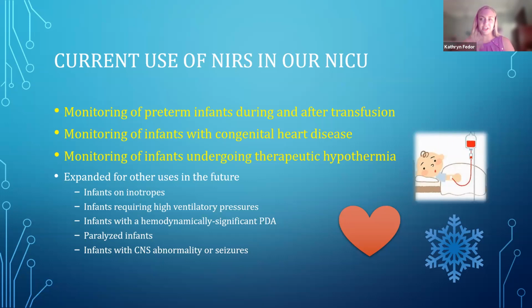And I feel like we're just at the tip of learning what is to come. So I'm excited to see what we might learn from NIRS in the future. What we're hoping to bring into our unit with NIRS, and we're really excited for some of the research that will hopefully come out, so we can start utilizing this in different ways, is any infant on pressors or inotropes, requiring high ventilatory pressures, or infants with hemodynamically significant PDA.